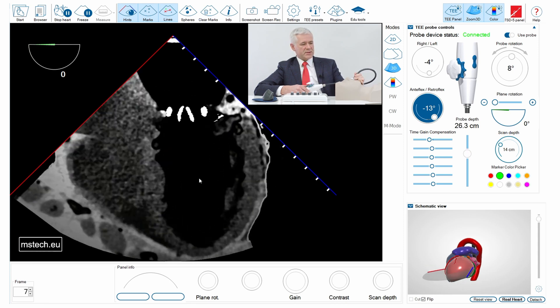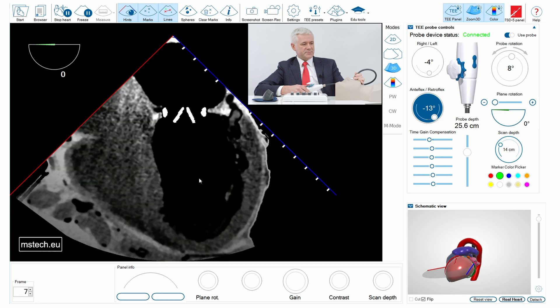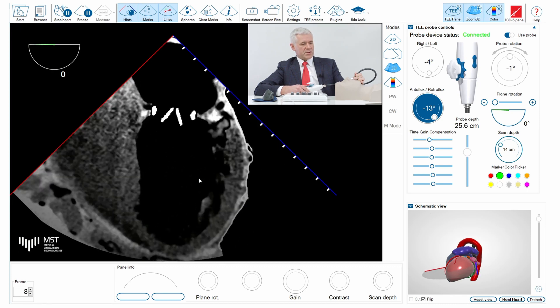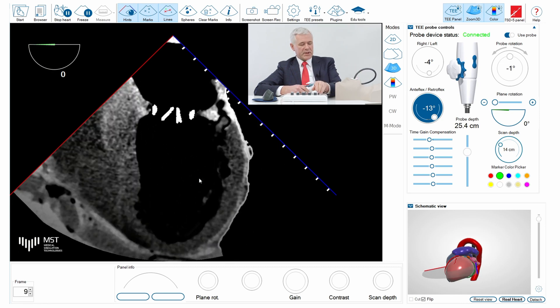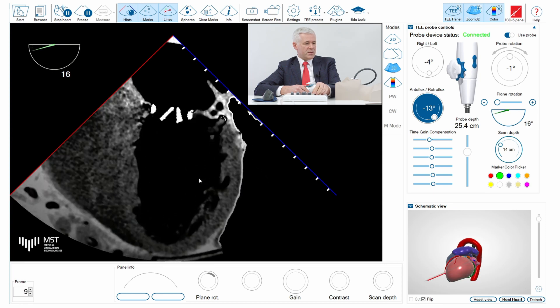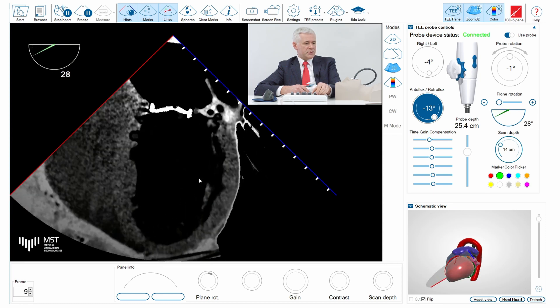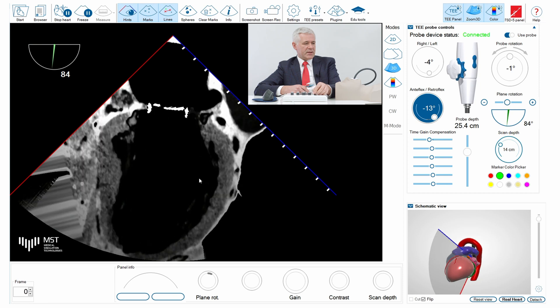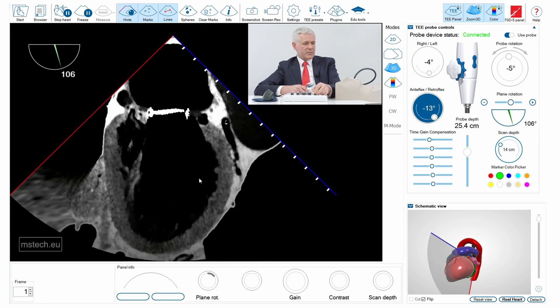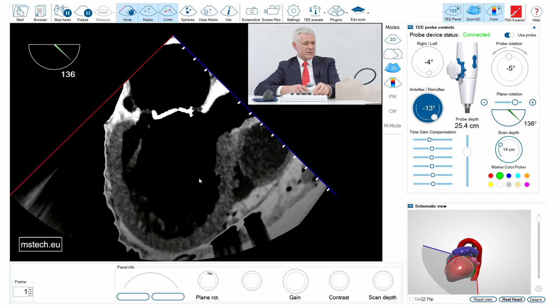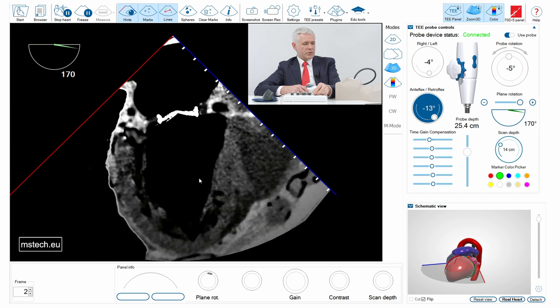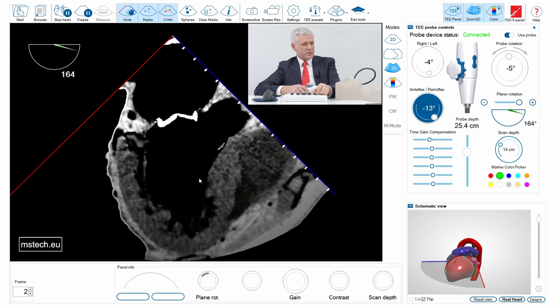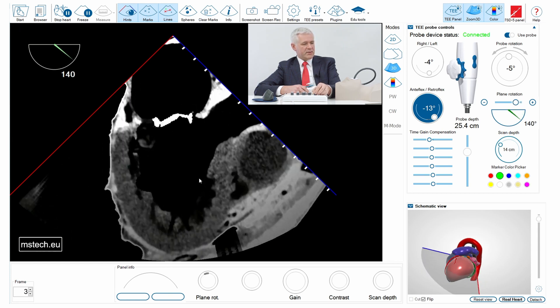Now I will rotate the plane from zero to ninety degrees and then more degrees to see if the motion of the discs is okay — and I think it is.